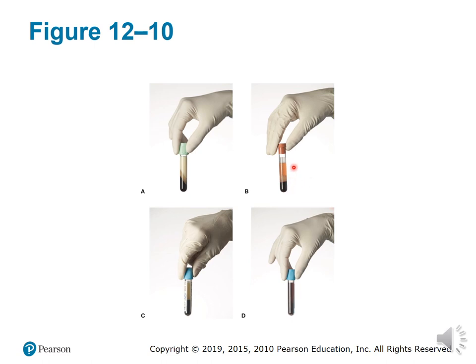It did separate, but as you can see, it's got that pink tinge to it. Usually that's a sign of hemolyzation, meaning either it wasn't transported back to the lab in time, or the patient had a very slow draw to where the red blood cells started to break down before it went through the centrifugation phase.